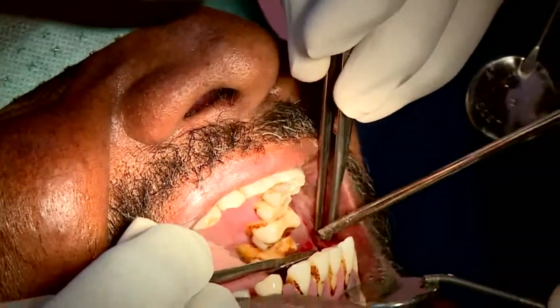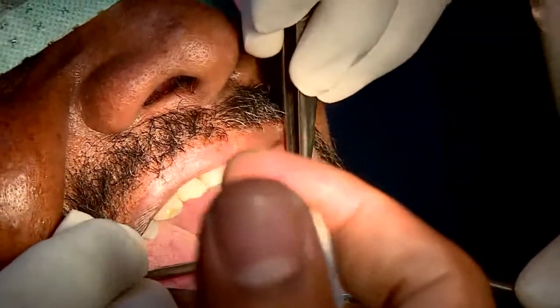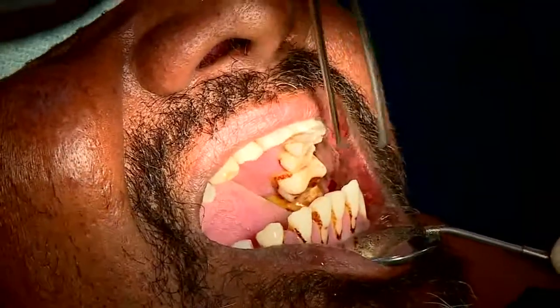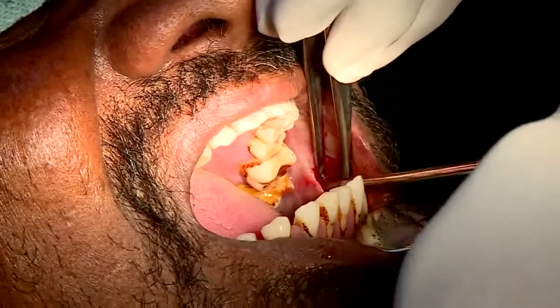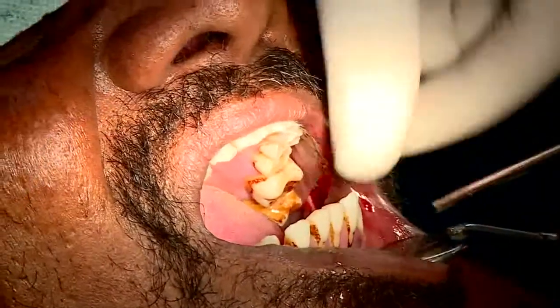So we make the incision, you have to hold on to the forceps, retract the tissue away, and then slowly make the cut. Do not worry about that. You can finish the procedure and then control the bleeding.